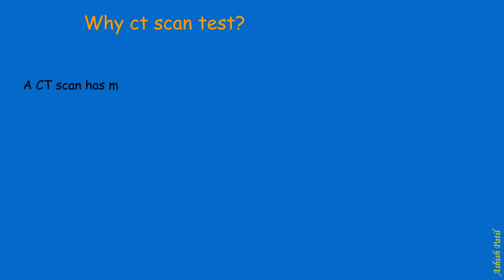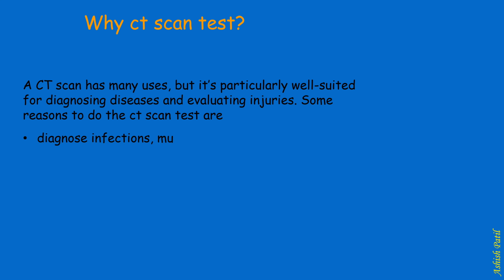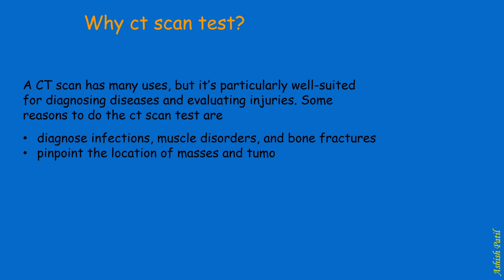A CT scan has many uses, but it's particularly well suited for diagnosing diseases and evaluating injuries. Some reasons to do the CT scan test are: diagnose infections, muscle disorders, and bone fractures. Pinpoint the location of masses and tumors, including cancer.